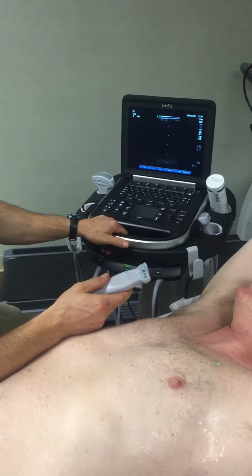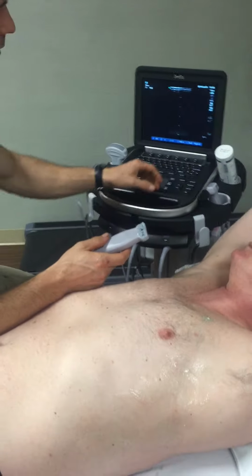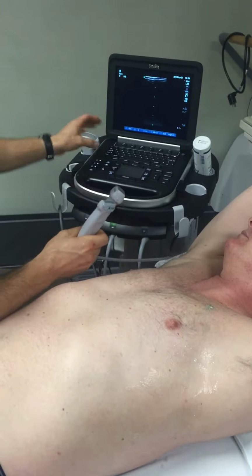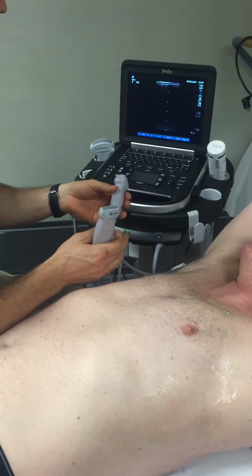Today we're going to discuss image acquisition for the lung exam. You can use any number of probes to do your exam. You can use the phased array, you can use the linear probe, or even the curvilinear probe. It depends on the patient body habitus and what you're looking at.